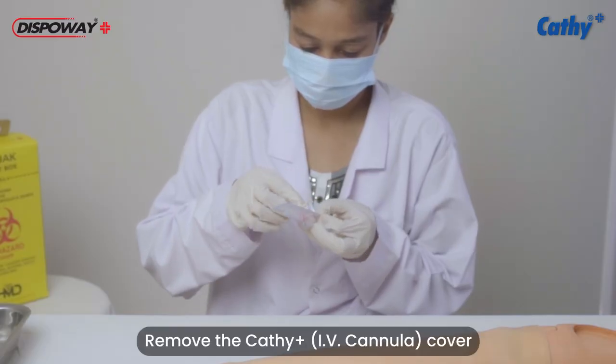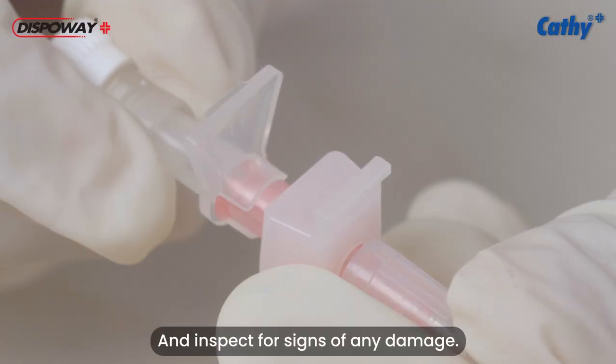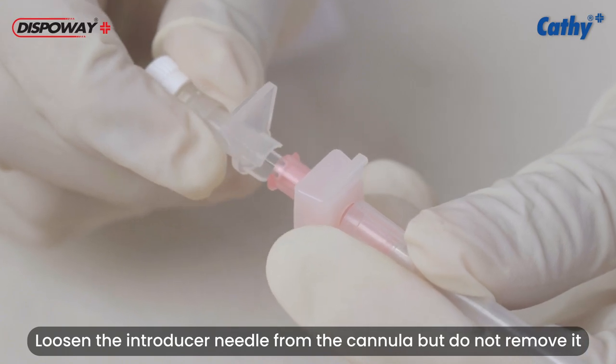Remove the Cathy Plus IV Cannula cover and inspect for signs of any damage. Loosen the needle introducer from the cannula but do not remove it.